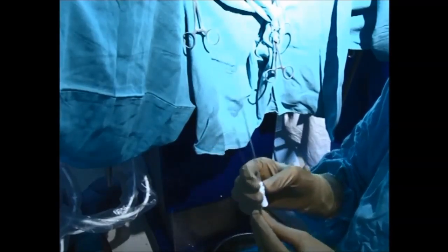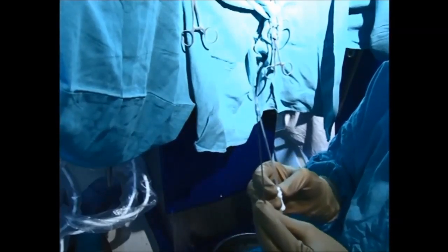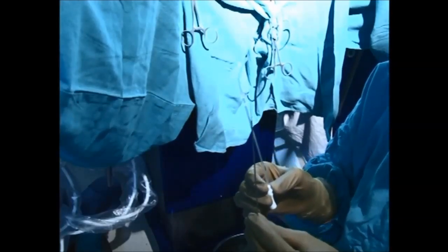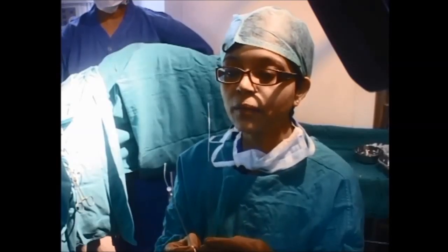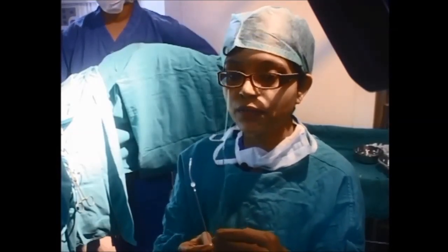They are really fine and really soft, and this is in contrast to what catheters used to be even just a few years ago. We have seen that a soft catheter drastically improves our pregnancy rate. I am going to hand over the soft catheter to our embryologist, who will show you how we typically load embryos. First, I will show you how we prepare the patient just before we do the transfer.